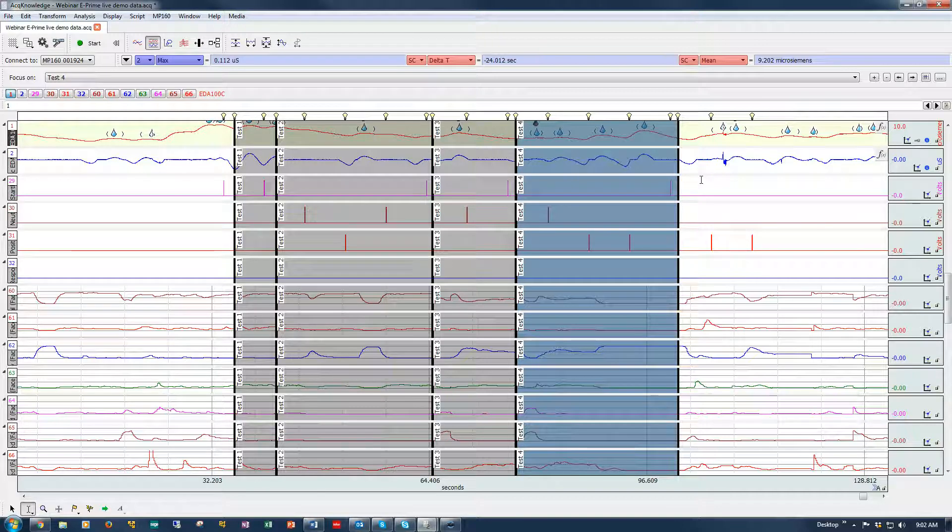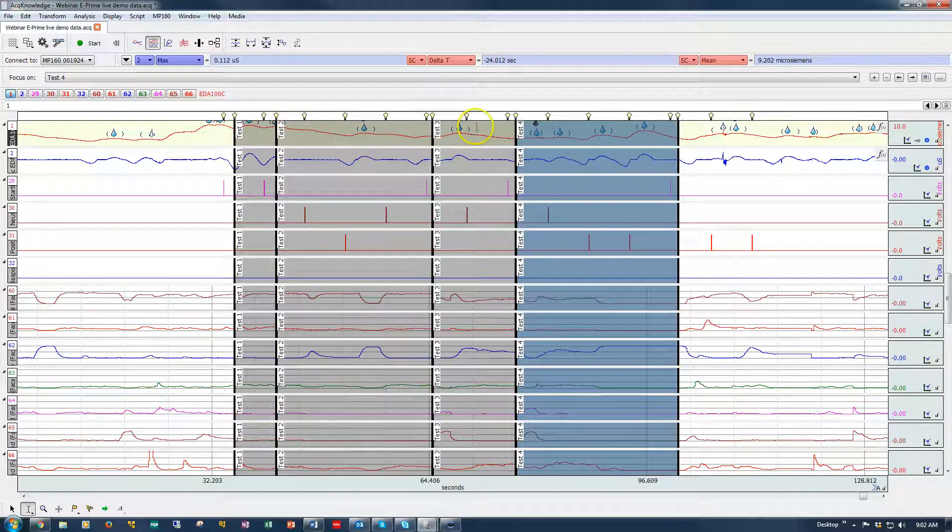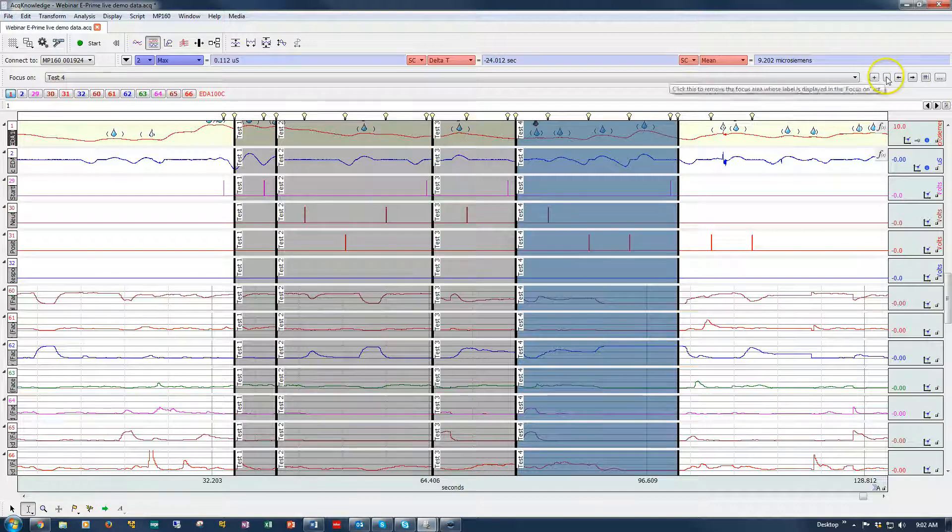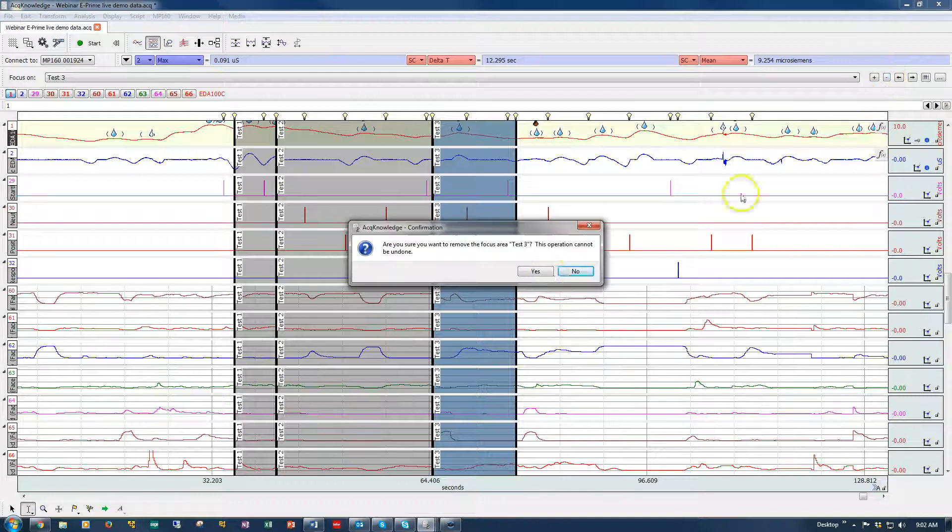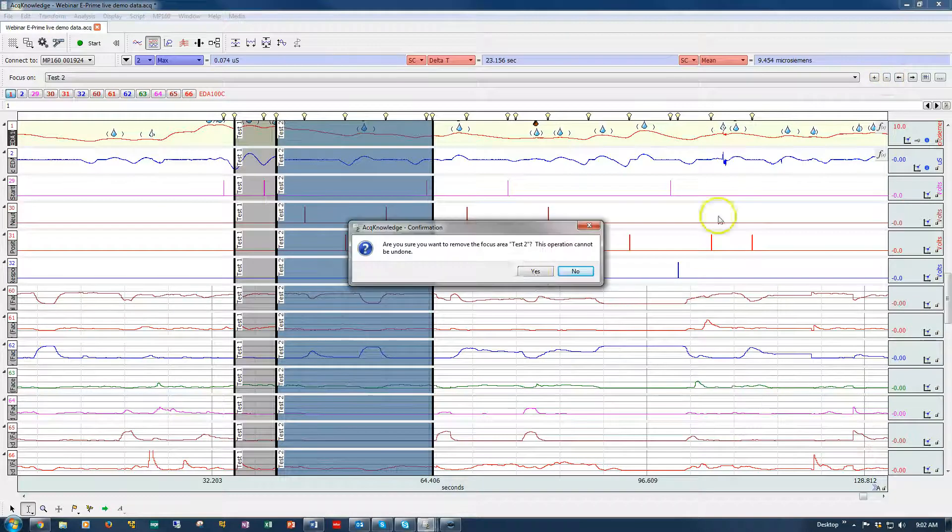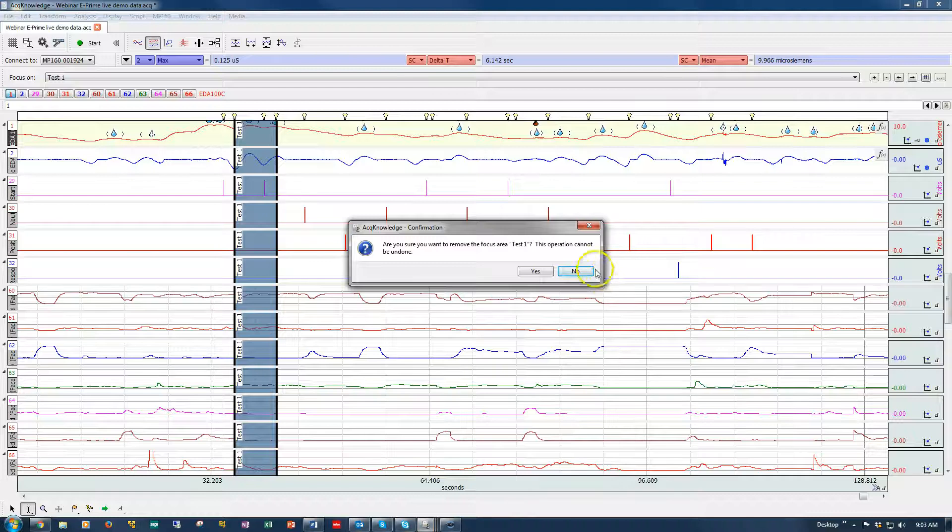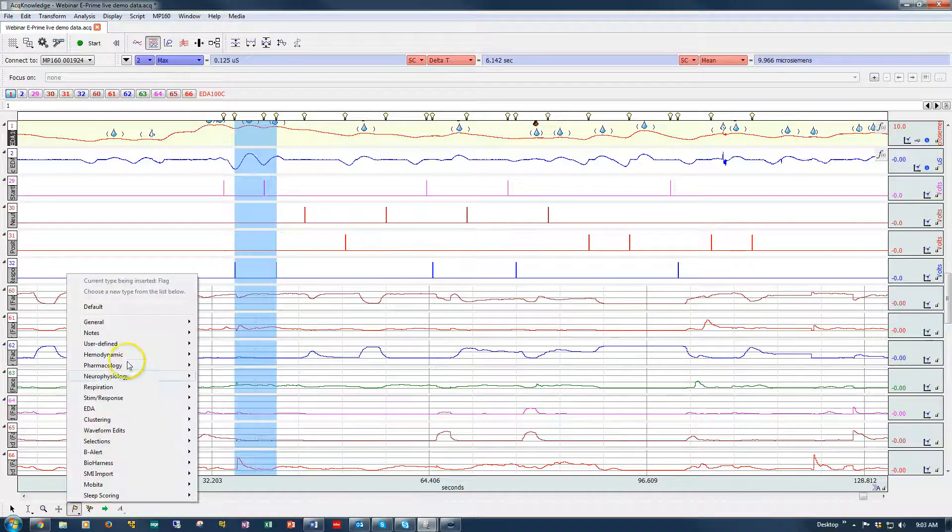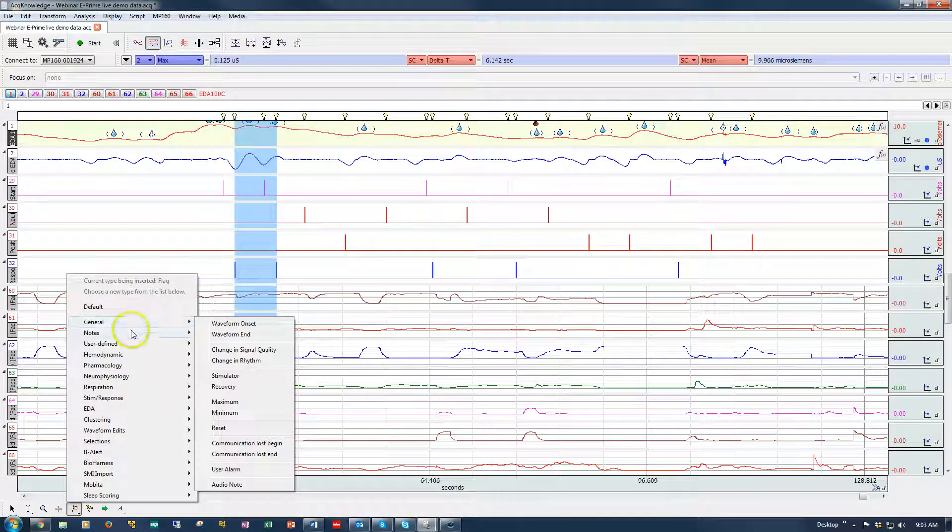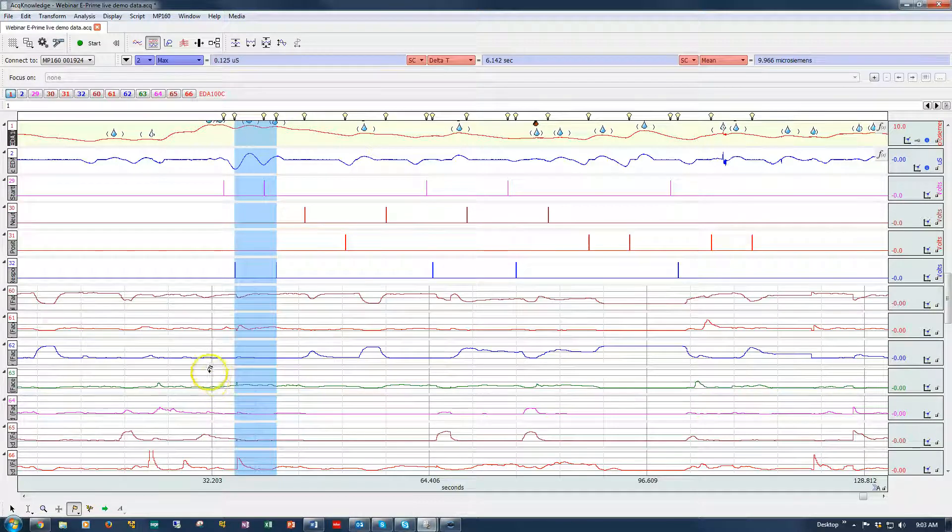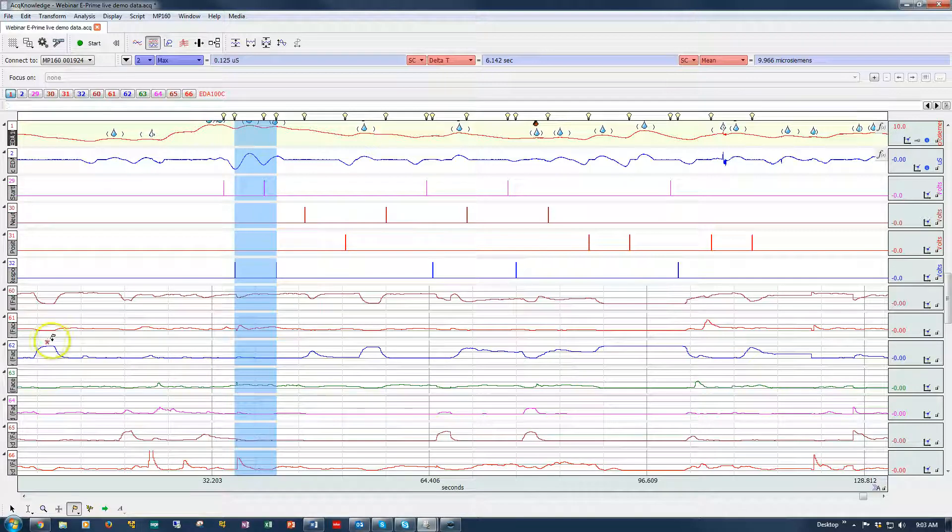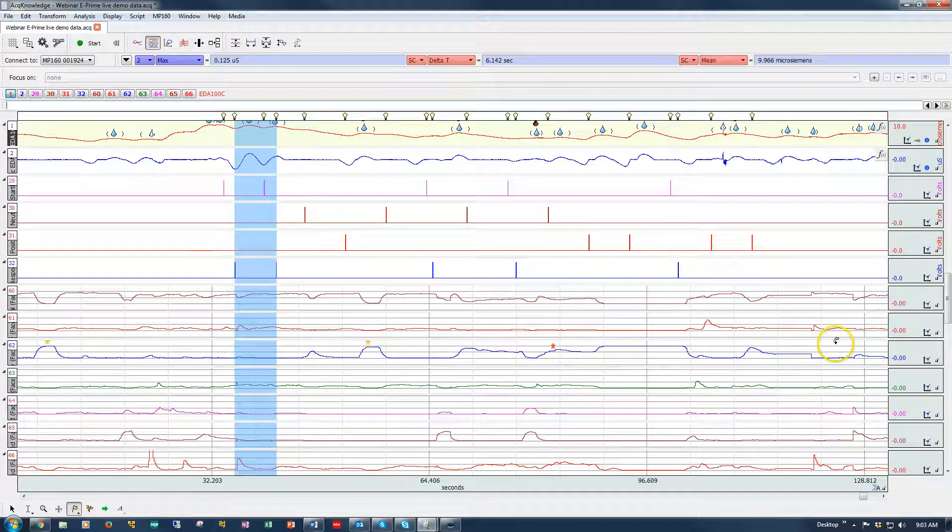It doesn't have to be events stimulus delivery type. You can go in there and create an event. I'm going to close these out and I'm going to add in some events. And I'm going to select the event type. I'm going to put a star on this channel here. Another one here. Another one here. And another one here.